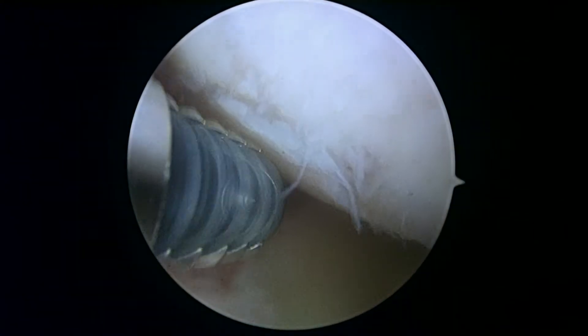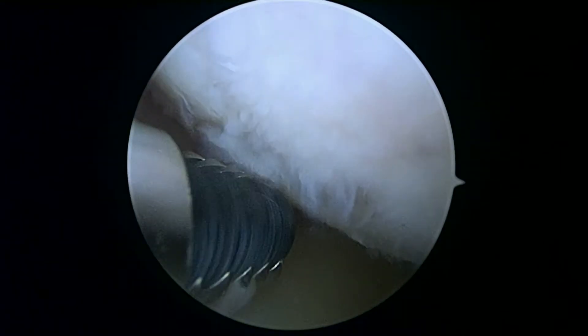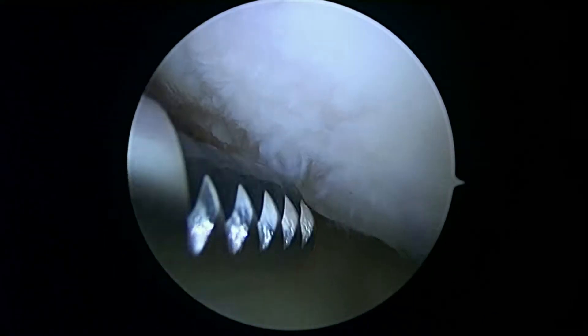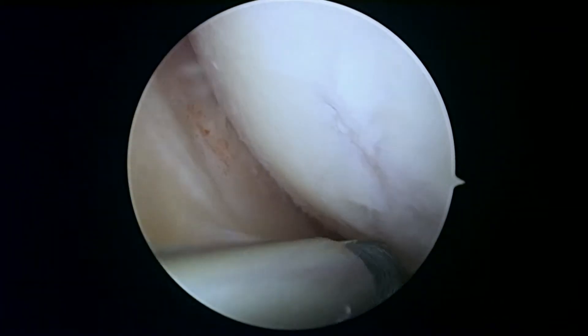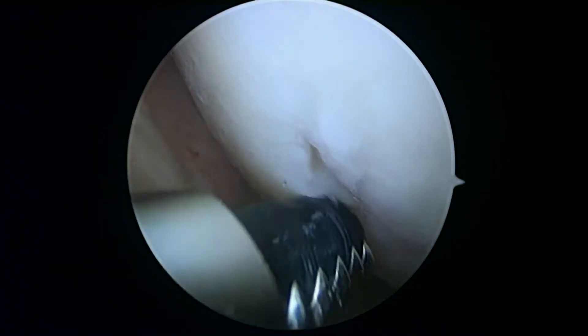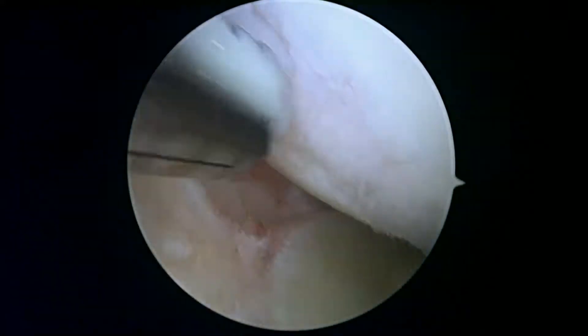Signs of working and playing hard for a bunch of years. Any of these areas that are loose, we're going to try and smooth out today so that they don't cause problems in the near future. But you can see how some of these areas are relatively unstable, and I don't want to remove any more than I have to.